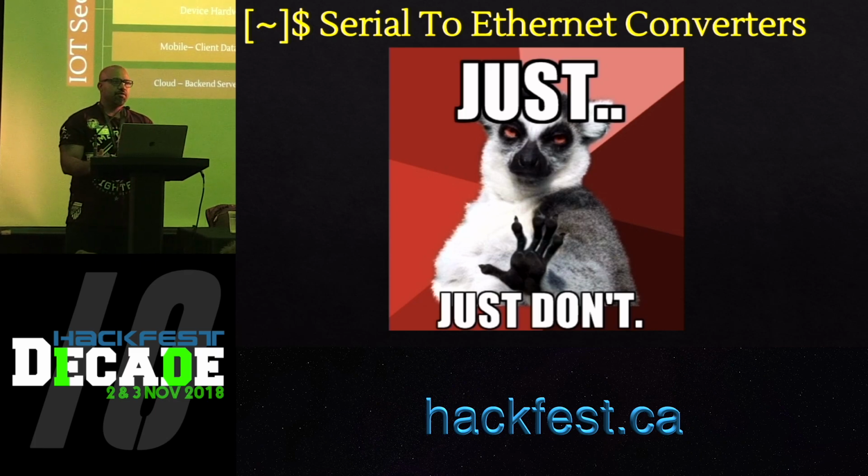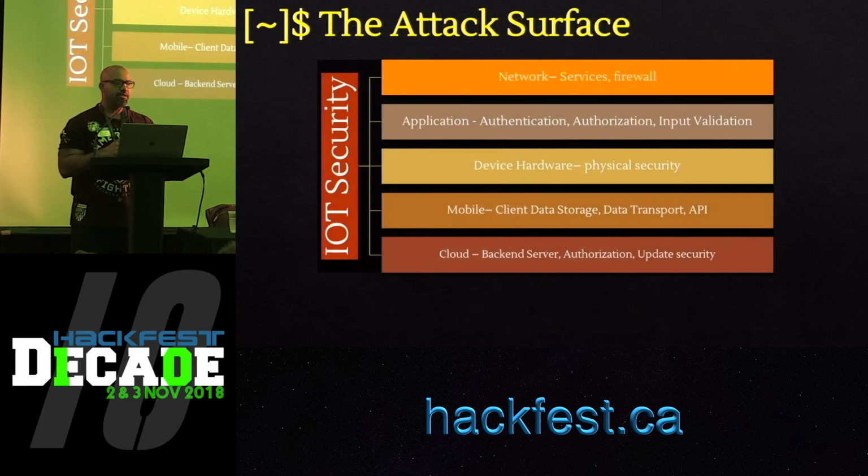So in terms of the attack surface, it depends on the size of the medical device. An insulin pump isn't that big a device, and if you look at them, they look like small, trivial devices. But if you look at the attack surface, they have a lot of subsystems. There's the network part of it. Then there's the application associated with the medical device. There's the physical device hardware itself. There could be a mobile application associated with the medical device. And then there's cloud infrastructure supporting the particular medical device. So the attack surface is actually quite large, and vulnerabilities from different platforms could be exposed through a single small medical device.